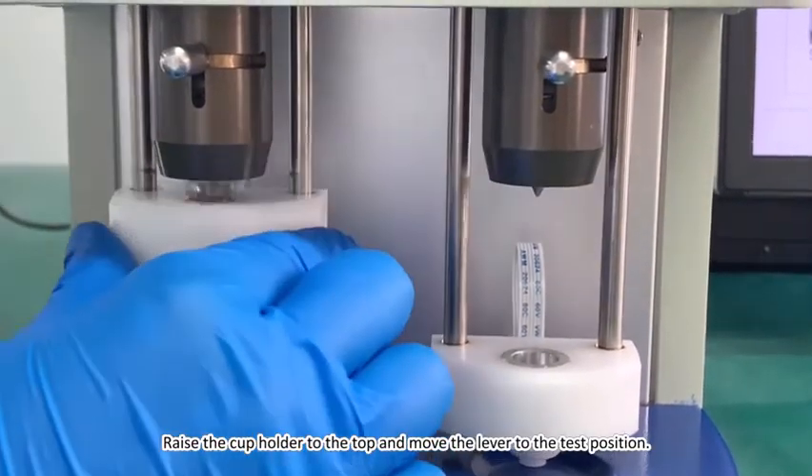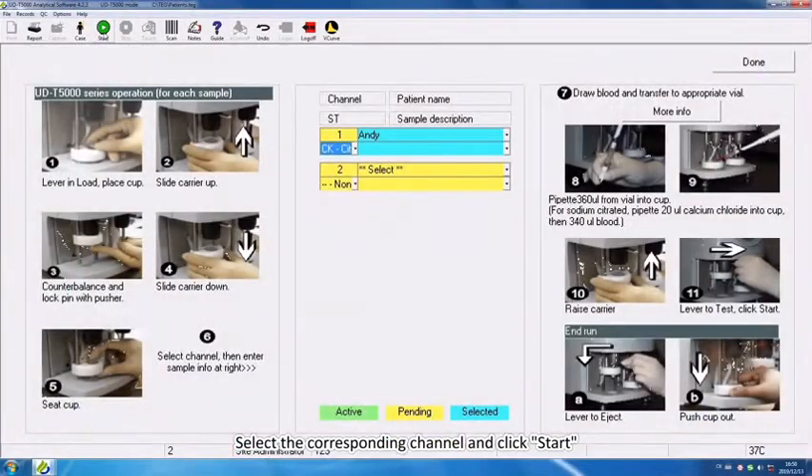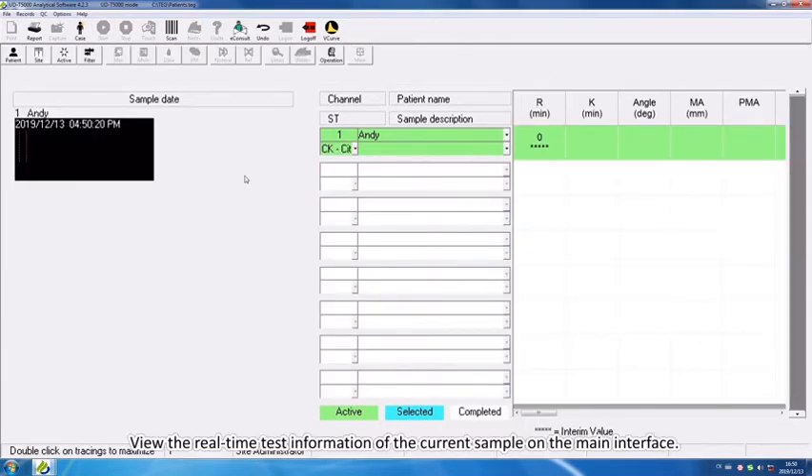Raise the cup holder to the top and move the lever to the test position. Select the corresponding channel and click Start. View the real-time test information of the current sample on the main interface.